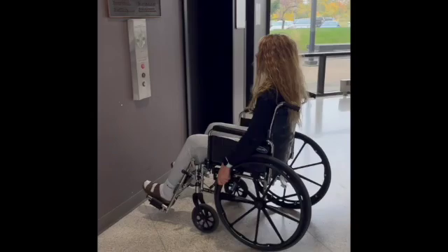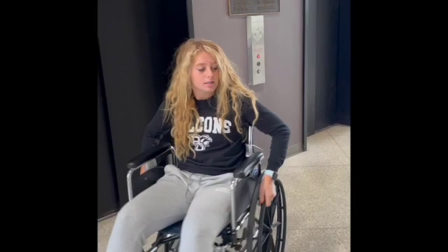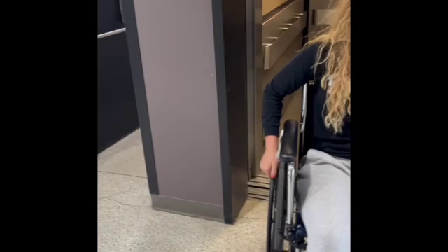To enter the elevator, get as close as possible to the wall, push the button, and then turn around to go backwards into the elevator. Make sure nobody is coming out. Wheel yourself backwards, watching where you're going. When you arrive at your floor, come straight out forward.